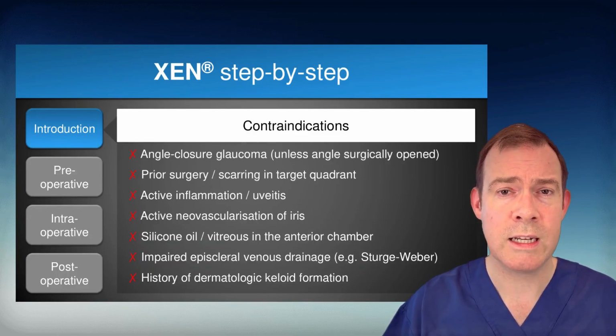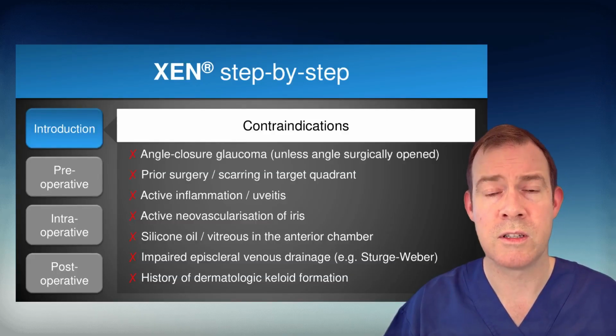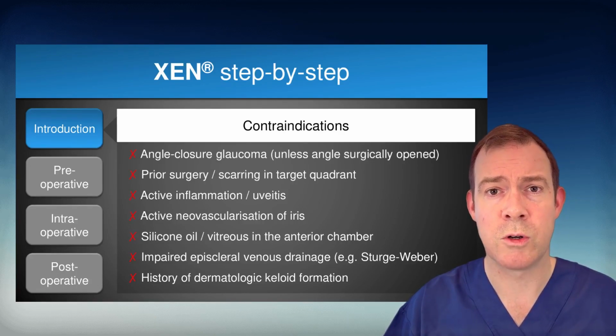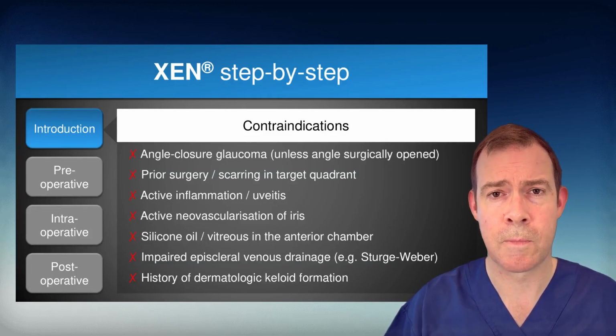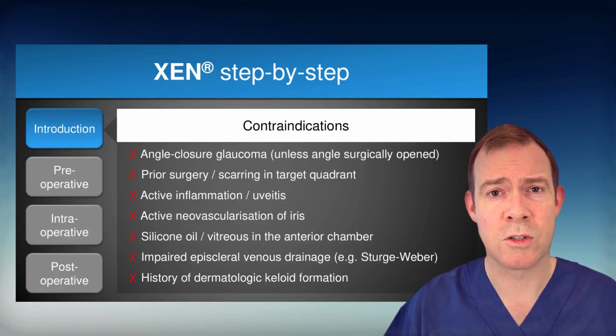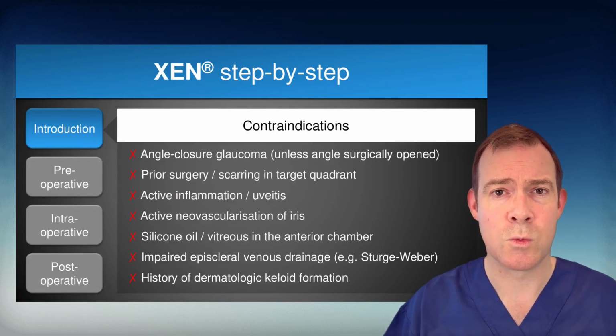The XEN is contraindicated in angle closure except where the angle has been surgically opened, such as with cataract surgery. Similarly, it's contraindicated if there's prior surgery or scarring in the target quadrant, or if there's active inflammation or uveitis, including neovascular disease. If there's silicone oil or vitreous in the anterior chamber, this may occlude the XEN and the XEN should not be performed. And similarly, if there's impaired episcleral venous drainage or a history of dermatologic keloid formation, XEN is relatively contraindicated.